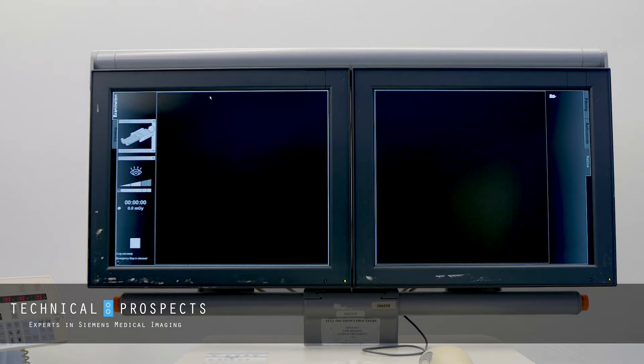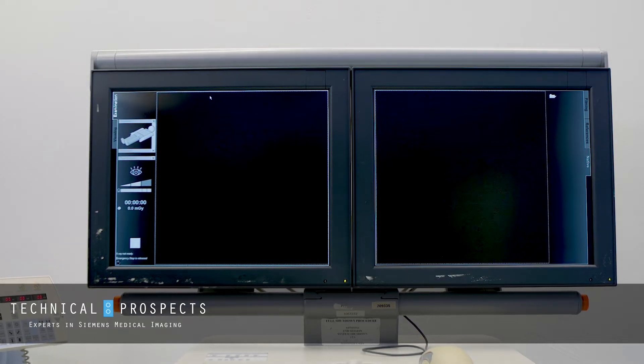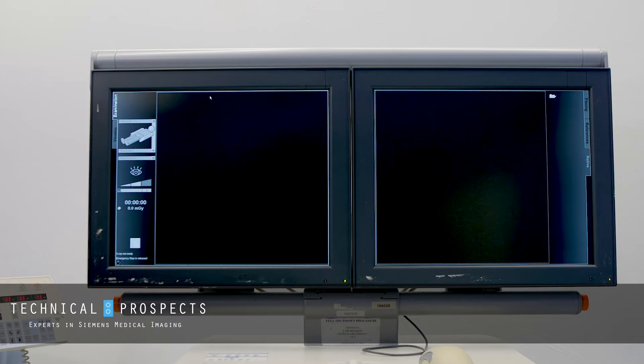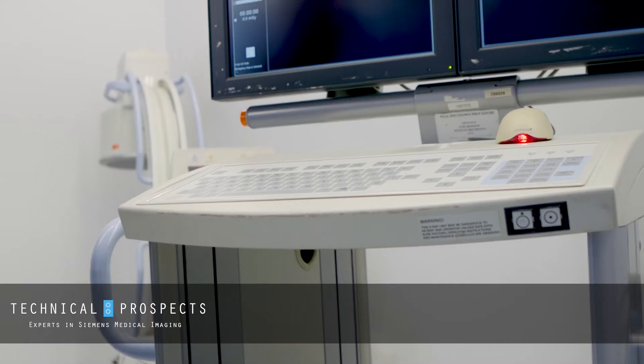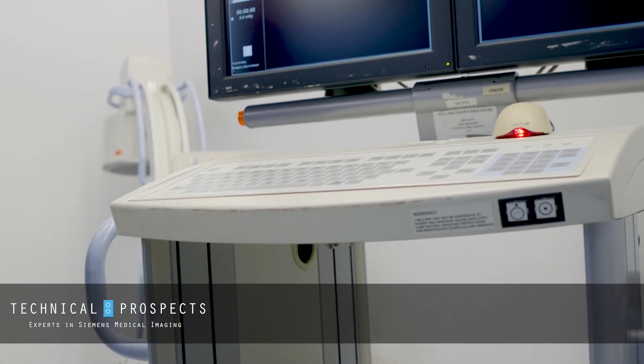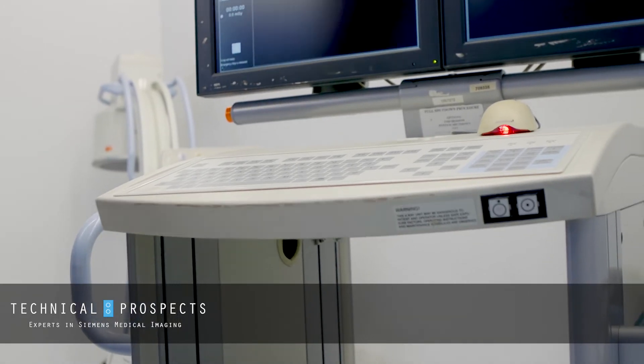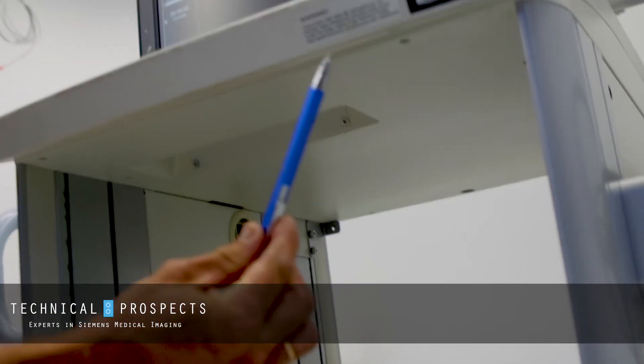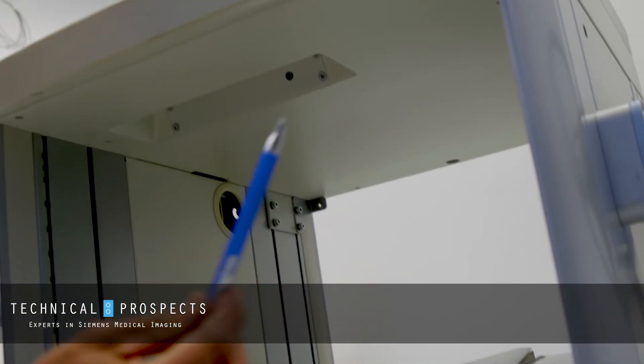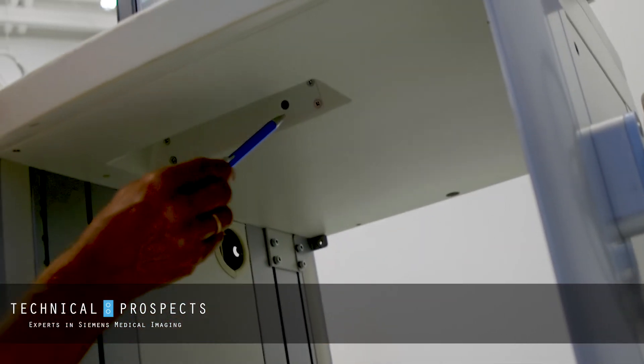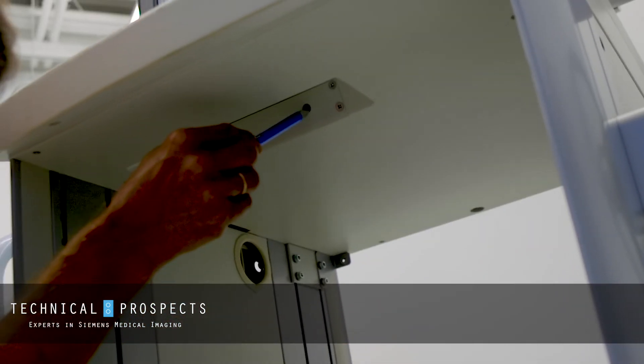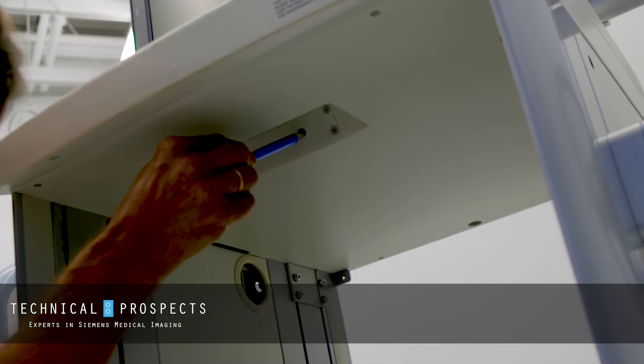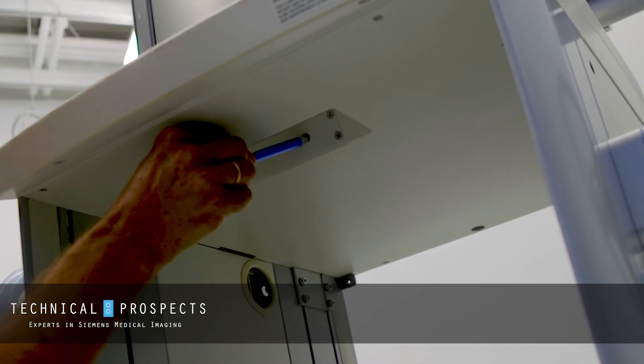So the most efficient and fast way to do it is to use a reset button. To reset the computer, you have to reach with something not too sharp but small enough to this area and just press it.